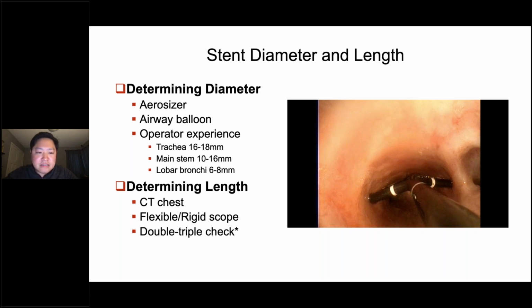because that's going to be the most important thing, especially when you're going through all this trouble to get the patient assessed, get the patient in the procedure room, do your debulking, and the last thing you want to do is place a short stent or too long of a stent where it doesn't fit and you have to replace the stent, because that typically adds another 20-30 minutes to your case.